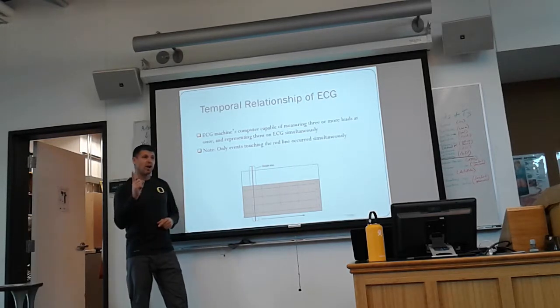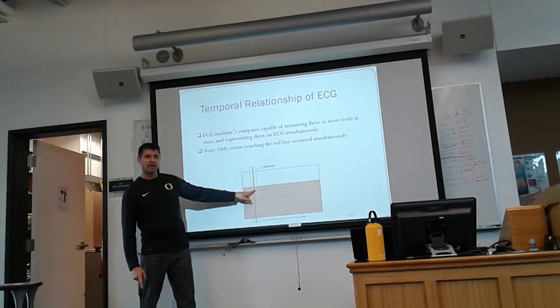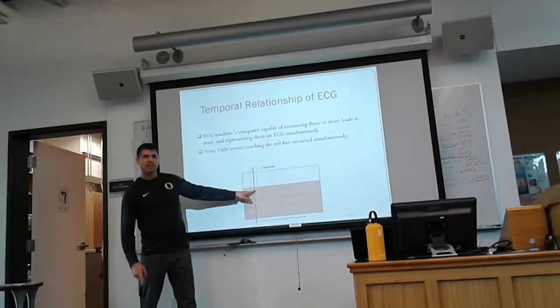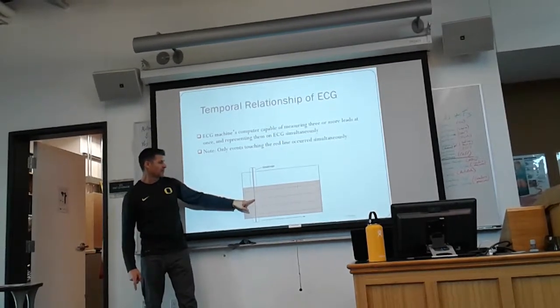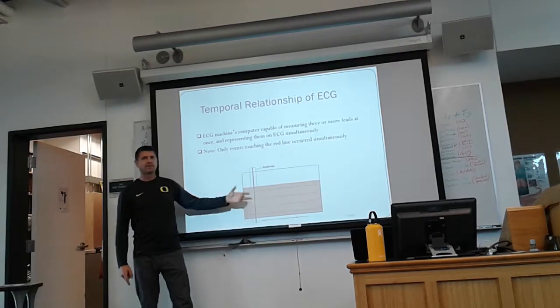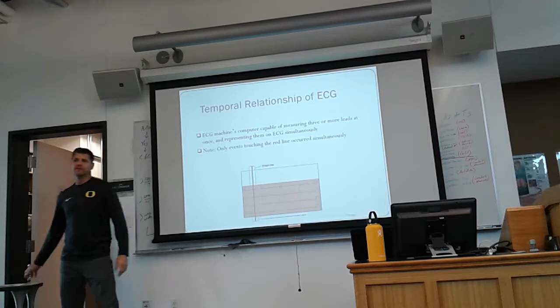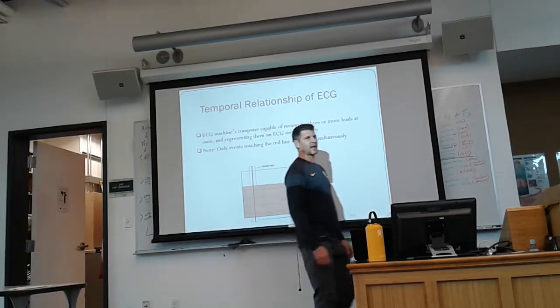But what we do know is that if you see a P wave right here, the P wave represents what? Atrial depolarization. If atrial depolarization happened right there, what happened right here? Atrial depolarization also happened right there. The lead two camera just couldn't see it for some reason. That's all it is. But everything that happens has to happen.